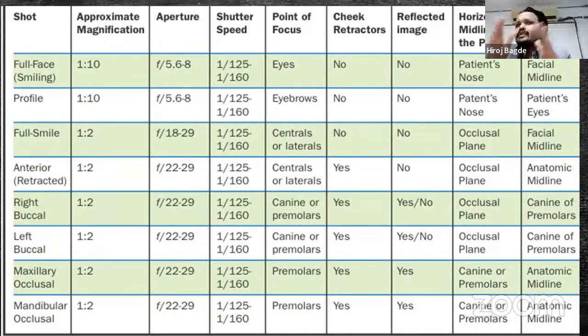there in the aperture, which cannot be done in a point and shoot or a mobile camera. Mobile cameras don't have this kind of provision where you can deal with the aperture. So that is the biggest disadvantage, where I can have much more detail. My details will be lost whenever I use a mobile.